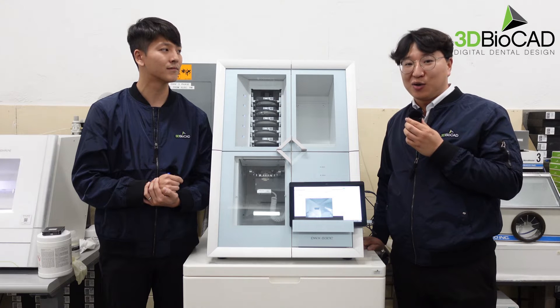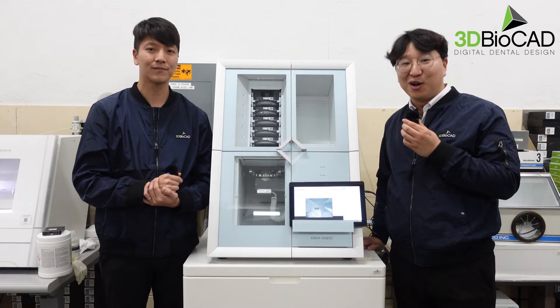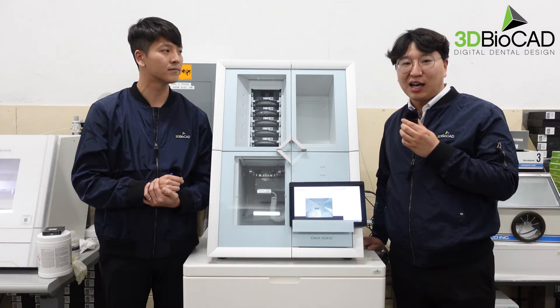As you're in your lab or milling center, a disc changer makes you go home on time. And also, as a clinic user, you can just put all your cases with multiple materials, put it in, then see your patient and save your time.